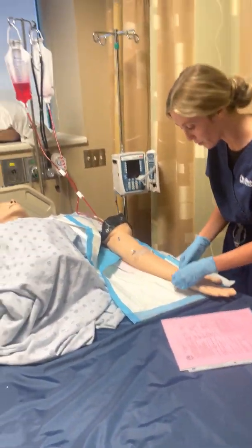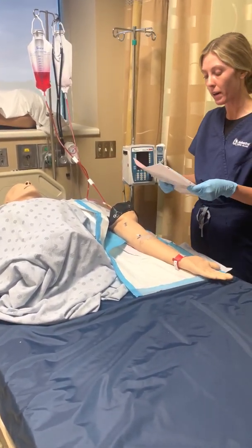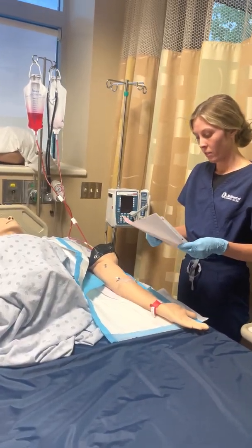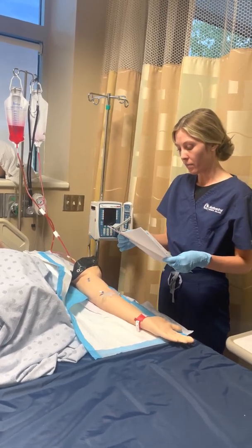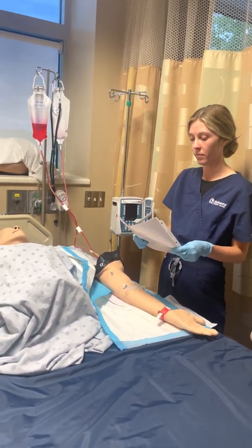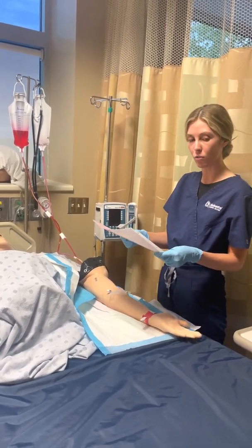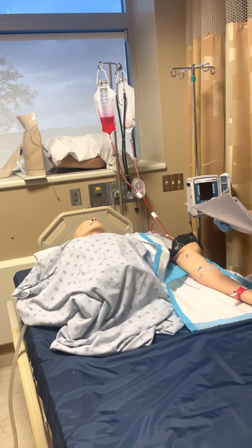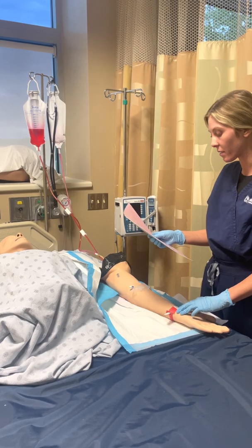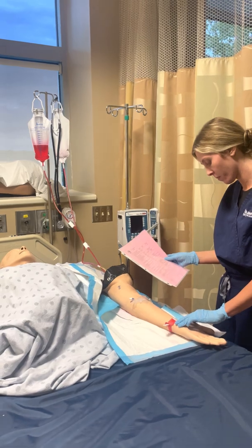Okay, Nurse Sam, so are you ready to go over the blood with me? Yep. Perfect. All right, so we have med rec number 224466. Med record number 224466. Location is HLRL. Location HLRL. And the account number is 123456. Account number 123456. We have Betty Jones here, date of birth 5/21 of 1952. We have Betty Jones here, birth date of 5/21 of 1952. And then the red armband number is 456654. The red armband number is 456654.